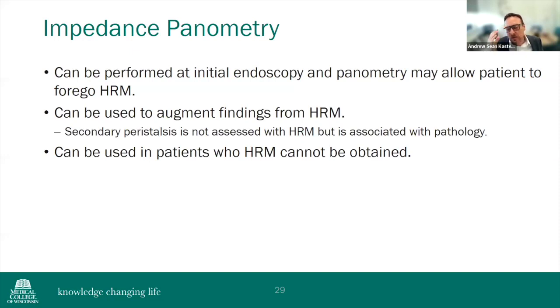The other is that you might have a really clear-cut contraction pattern that fits with a diagnosis, and so you may be able to be done after getting panometry and be able to avoid high resolution.